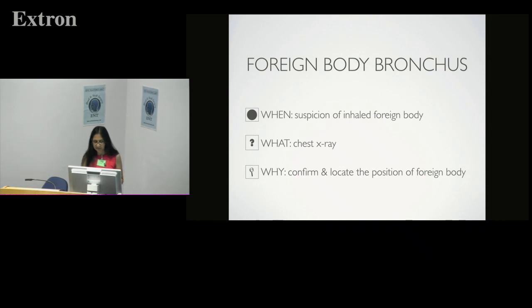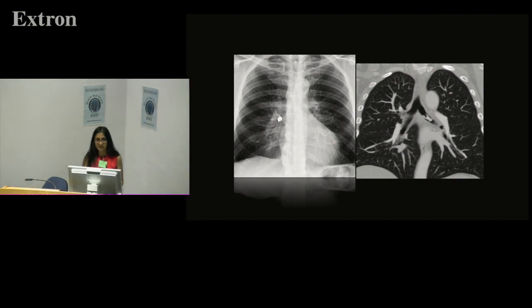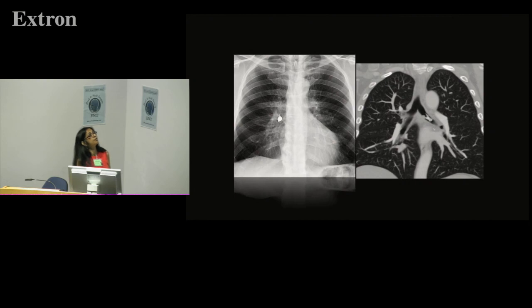When a patient presents with suspicion of a foreign body in the bronchus, you would do a plain x-ray of the chest to confirm and locate the position. Here is a dental amalgam that has gone into the right main bronchus.